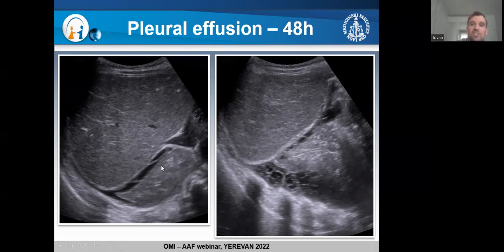After 48 hours, the child wasn't getting better, and the pulmonologist sent this child to us again for an ultrasound. Look at it. This consolidation is not much better than the previous exam. And look at this pleural space, not 2, but like 20 septas within this pleural effusion now.